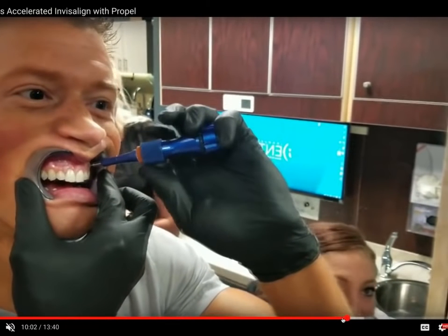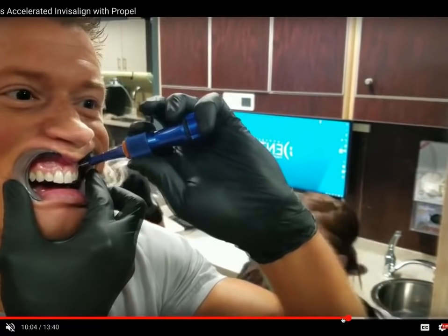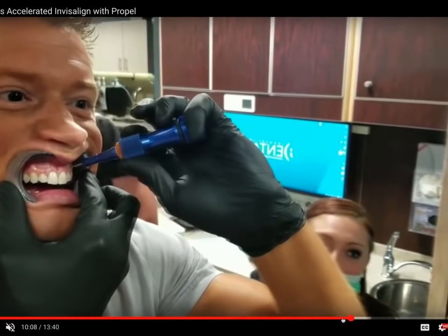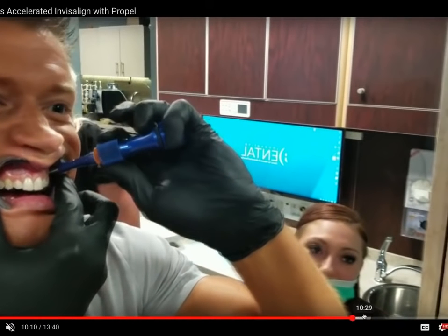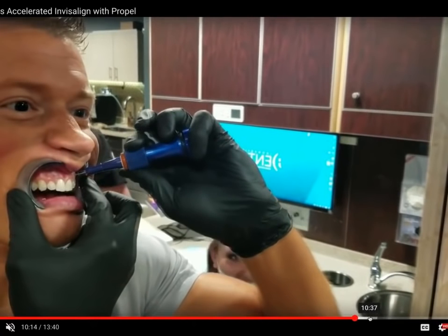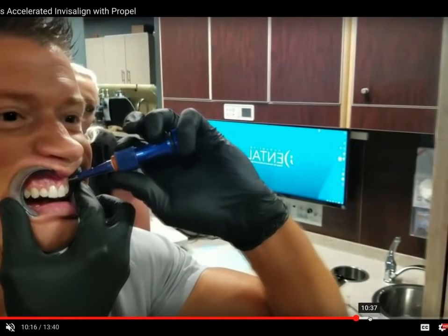And so this really allowed me to do that in a way that was kind of fun, unique. The team thought was pretty funny. I think here you'll see I get to have a little bit of fun with seeing how that engages the bone here. You can see I'm really working it in on that.